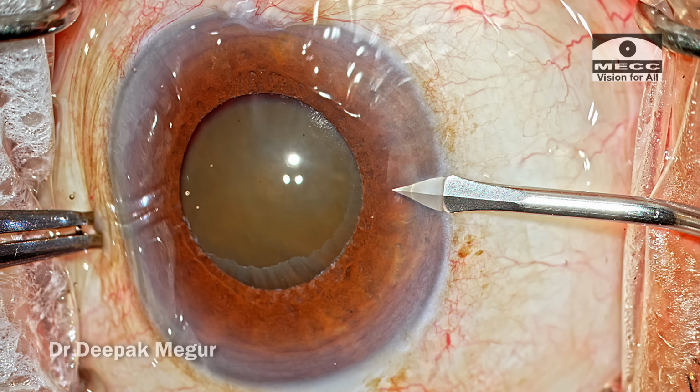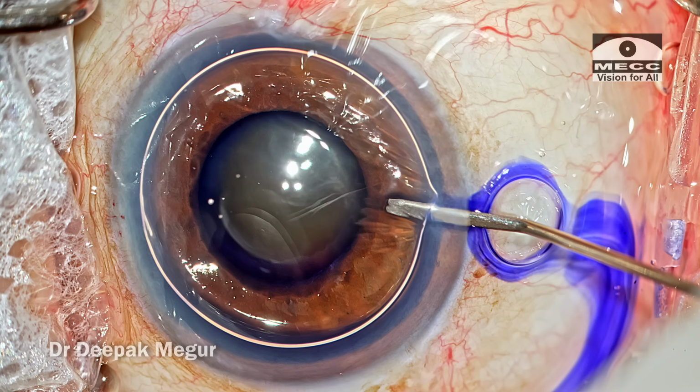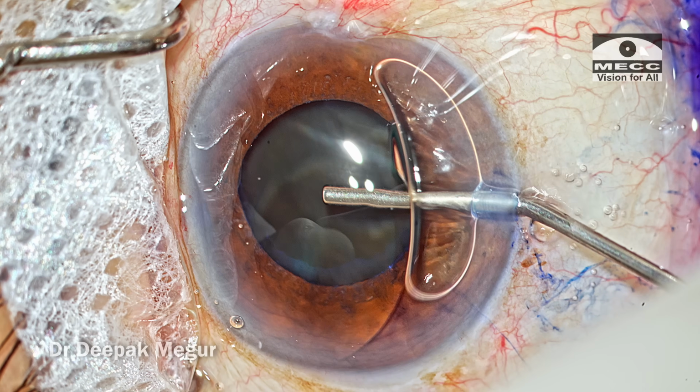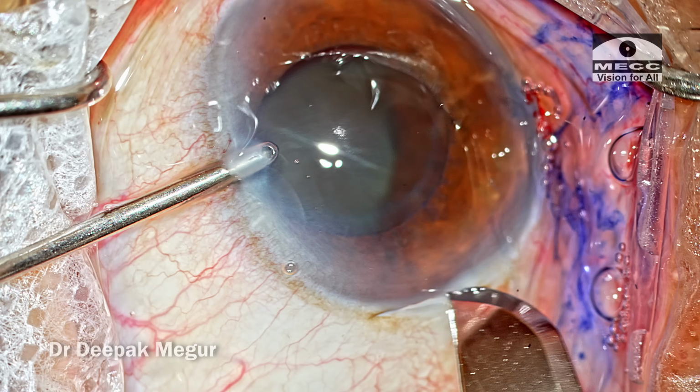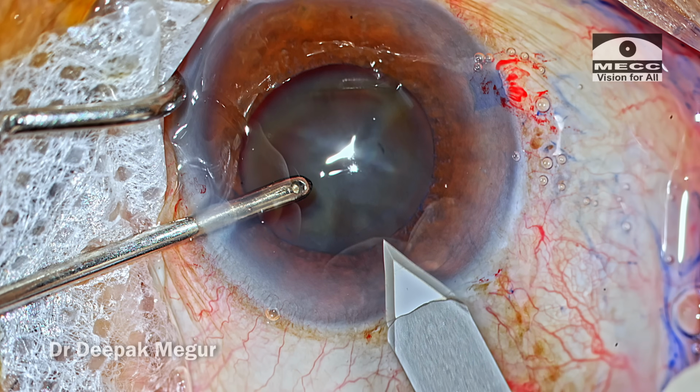The surgery is being done under a block, and 2 side port incisions are made. The capsule is stained with trypan blue. The chamber is filled with dispersive viscoelastic. The globe is stabilized, and a posterior limbal triplanar incision is created.